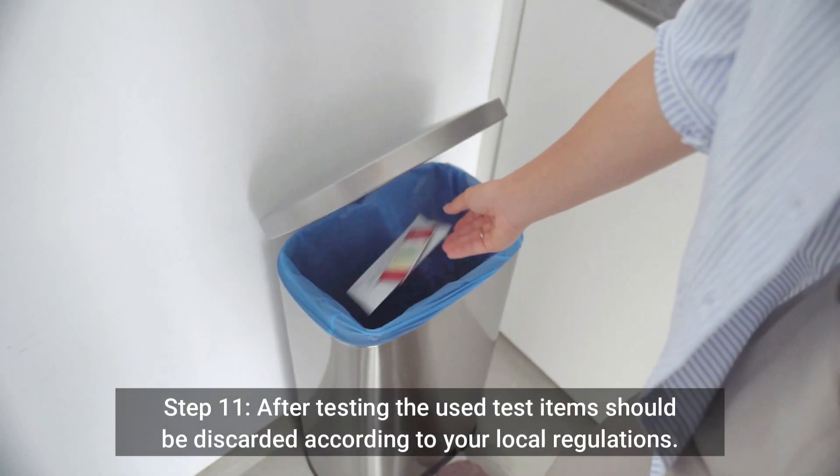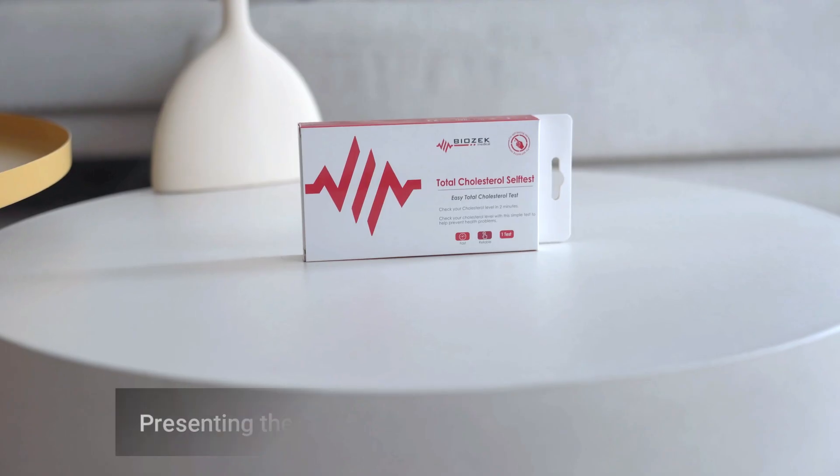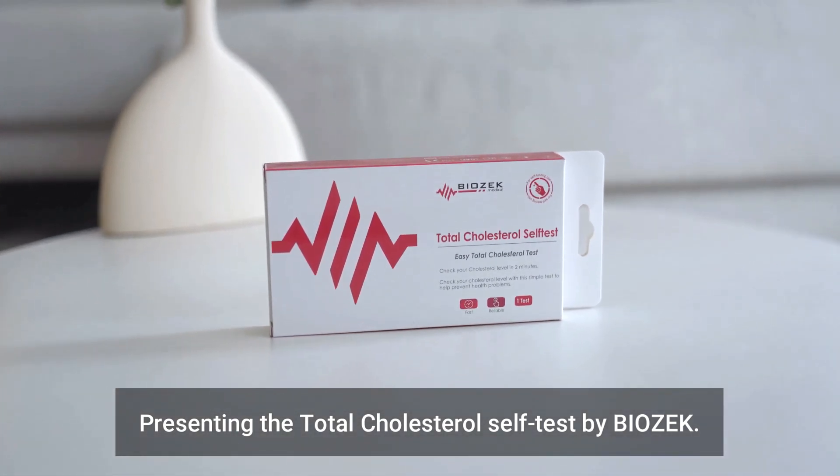Step 11: After testing, the used test items should be discarded according to your local regulations. Presenting the Total Cholesterol Self-Test by BioZek.